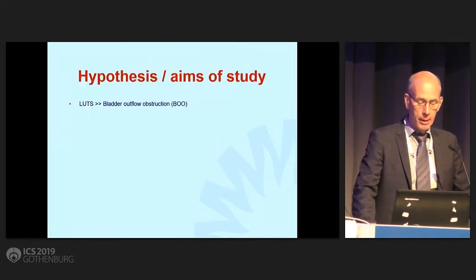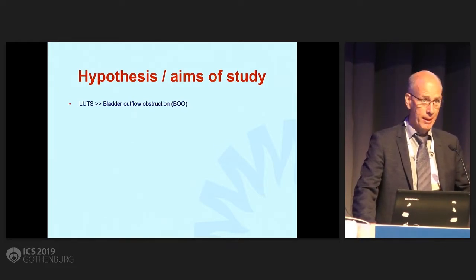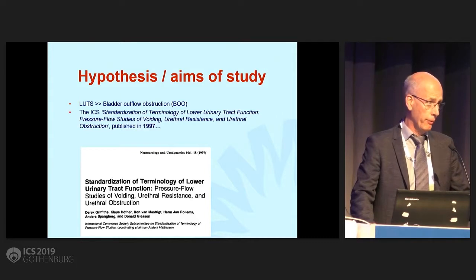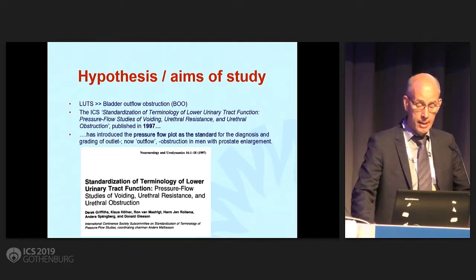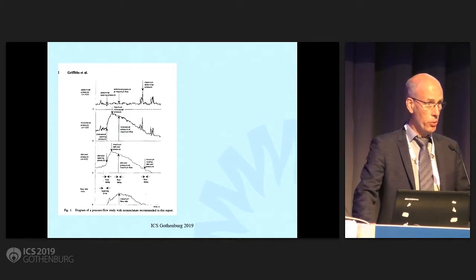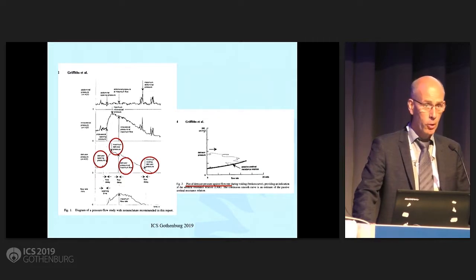There we go again. This is next generation urodynamics, and I'm going to be fast because this is a lot of knowledge in a few minutes. This is a very, very old standard, and it's a very, very ignored standard that we have in ICS. This standard says, please use this graph that you all know, but also use the pressure flow plot.